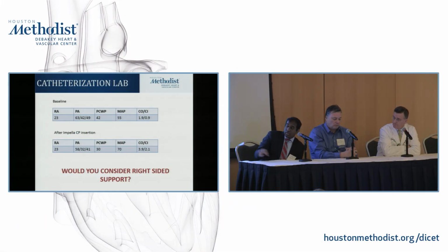I think that's the debate you're having, because right-sided supports come with a caveat, and I don't know what we did, but also when we talk about which support to use, the right-sided supports are not that easily prevalent. If you're going to touch on the available pumps later. Right. Okay. Yeah. So we'll wait for that.